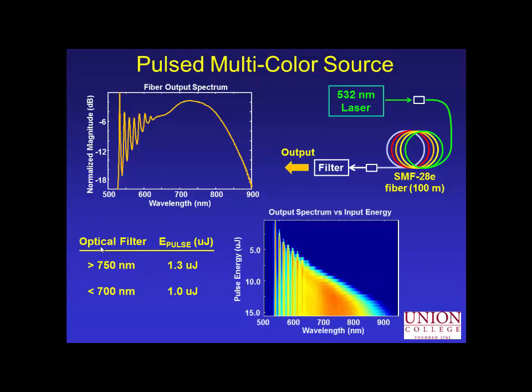If you vary the input energy, shown on the bottom here is the maximum case. And as you work your way up through this plot, obviously you have smaller and smaller inputs.